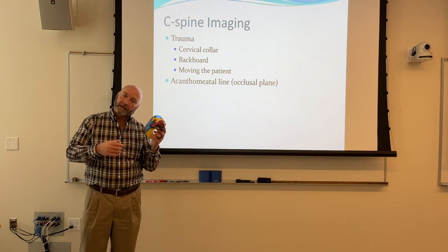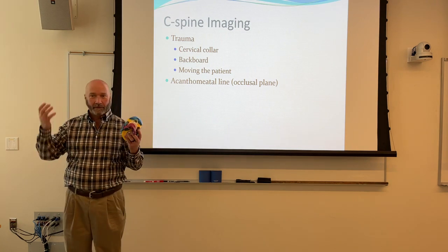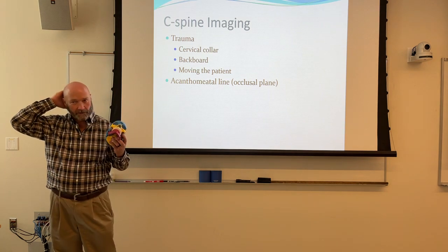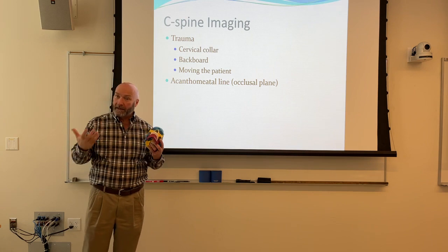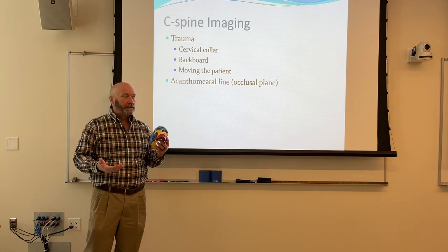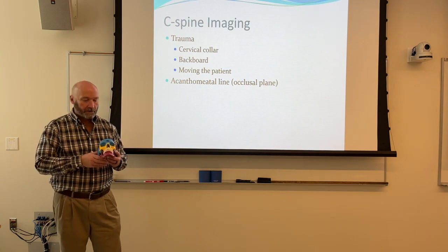Your patient's going to have a tendency to want to pull away from you, and that's going to feel good, right? Because they're getting off of that one sore spot on the back of their head, and then they're going to want to move their head all the way around. So again, do you really want your patient who has a potential neck injury doing that? And the obvious answer is no.